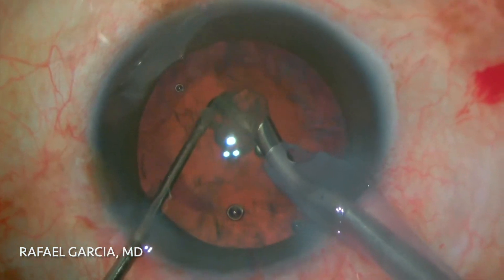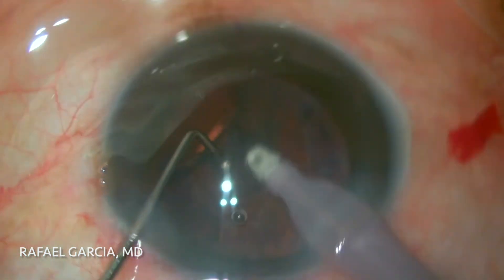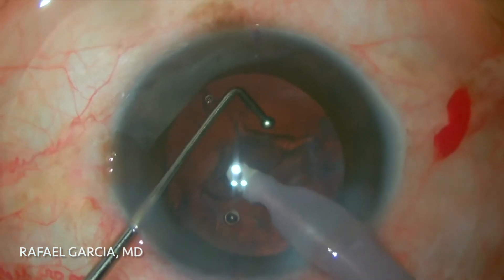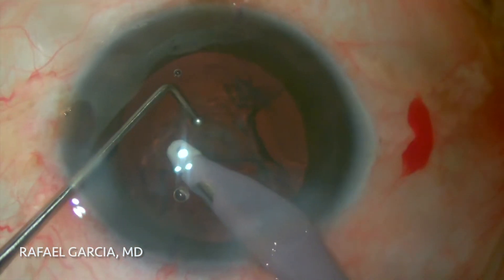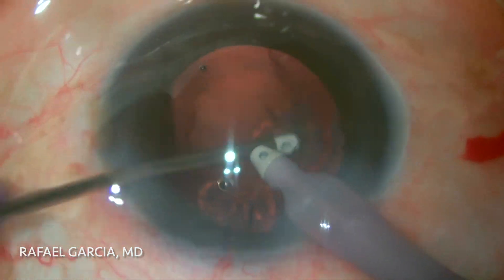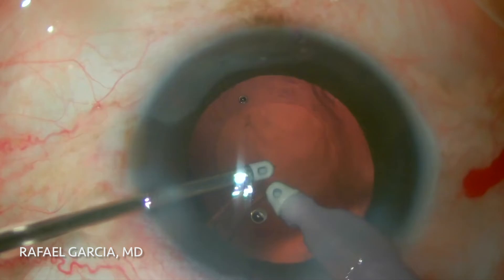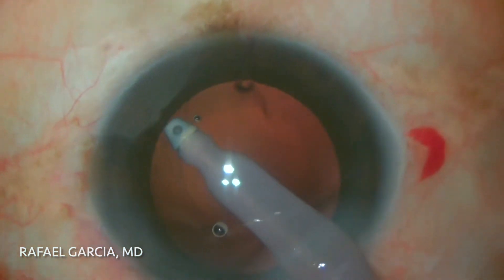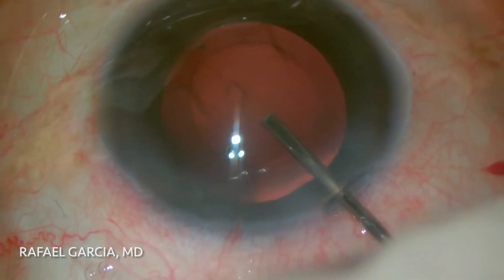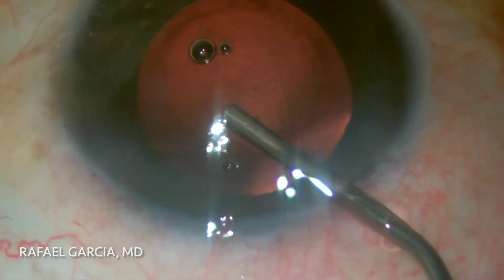Slowly but surely, all the pieces are taken down, and now comes the IA probe. There is still a thick epinucleus gel, and it is carefully dealt with. A smart move here is to use the Intrepid Transformer IA handpiece, which easily turns into a bimanual IA, giving us better and safer access to the subincisional cortex. Some polish is done underneath the rexis margin, as well as some irrigation of the central posterior capsule to release those tiny fibers stuck in that central area. The bag is then inflated with OVD.